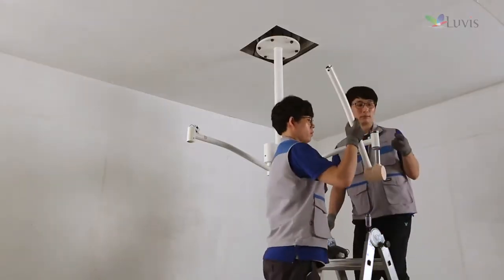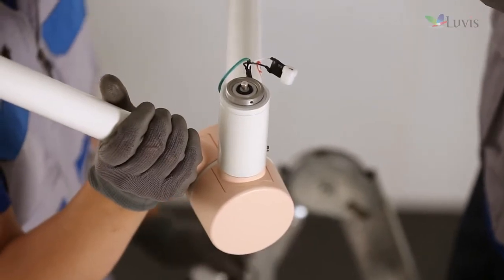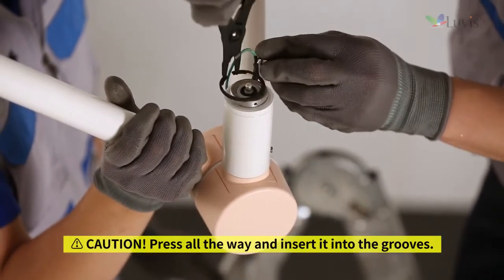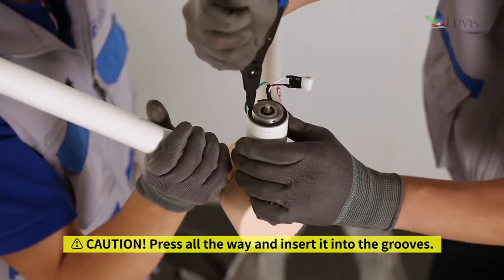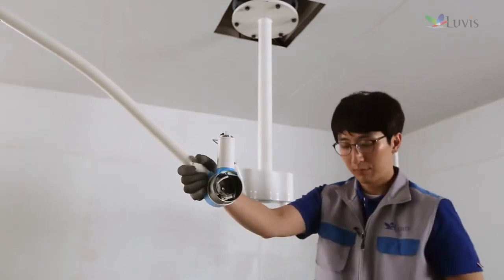Attach wall second arm one and first horizontal arm one as seen on the screen. Hook up the snap ring after raising first horizontal arm one all the way up.